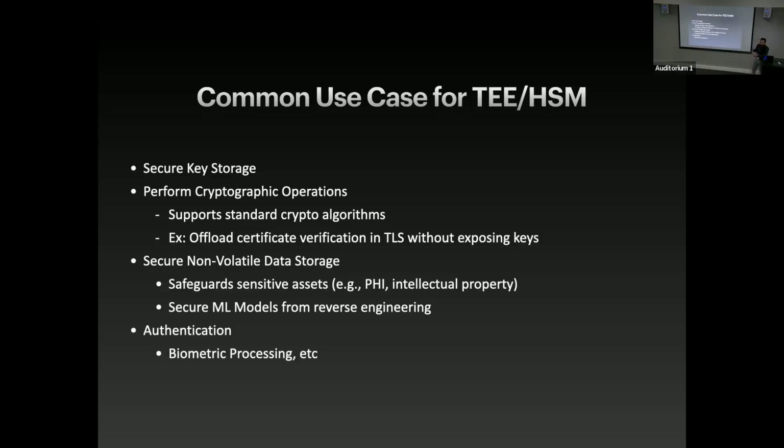So you can also use this secure storage as a general purpose storage, where you can store your PHI information, or any other sensitive information that you want to protect. You can also safeguard your ML models, like the ML models that predict some kind of disease before symptoms appear, for example cancer or any kind of disease. Because that's the heart of the device, attackers should not compromise this kind of model, because this is very crucial for the device to function properly. So you can safeguard these models from being reverse engineered by putting them in the TE.